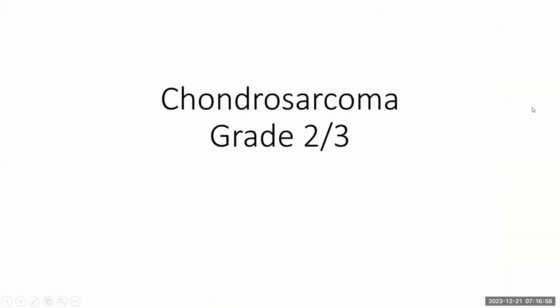So the diagnosis is chondrosarcoma with all the morphological attributes and S100 positivity. It's a grade 2 out of 3 because of, again, lack of high cellularity and distinct nuclear atypia and mitotic figures.